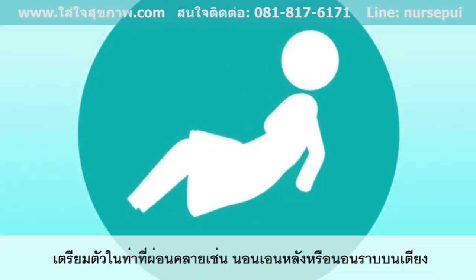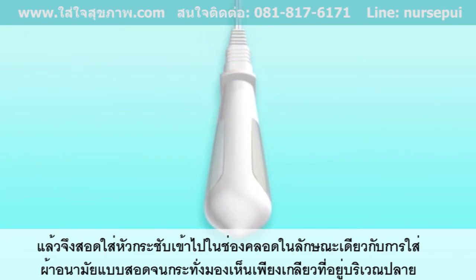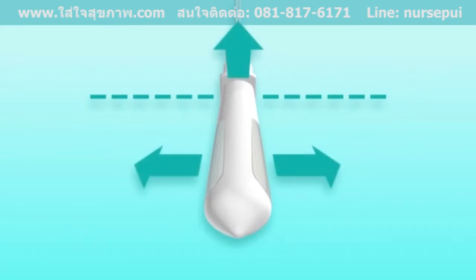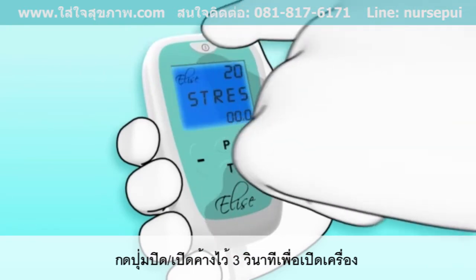Choose a comfortable position, such as leaning back or lying down on your bed, and make sure that the unit is switched off. Insert the exerciser into the vagina, in the same way as you would a tampon, until only the flange at the base of the exerciser is visible. Ensure that the exerciser is aligned so that the metal panels are to the sides and the curved edges of the flange are vertical.